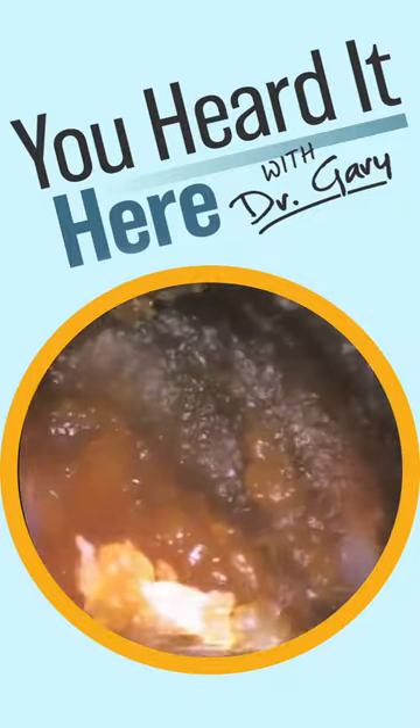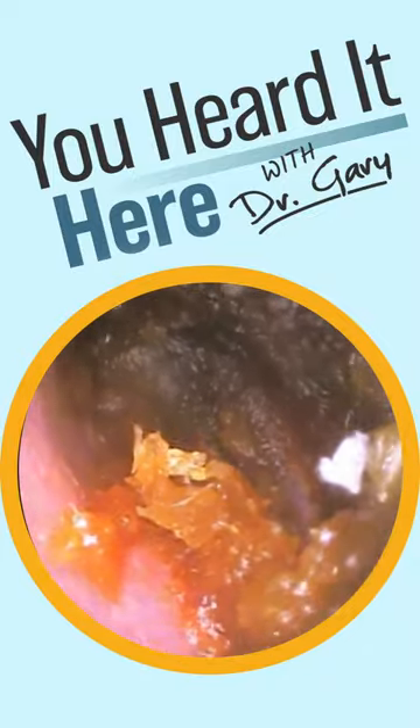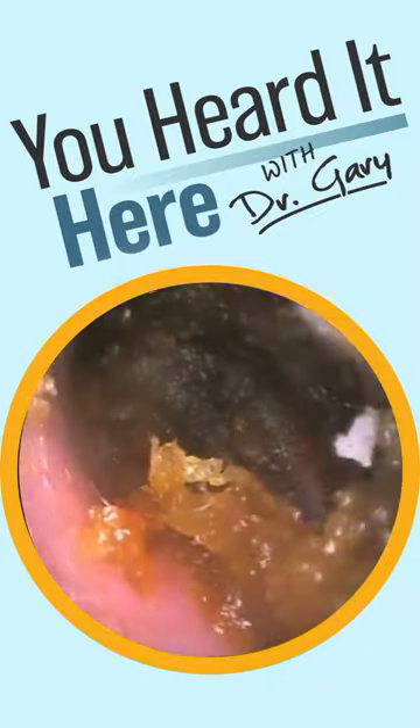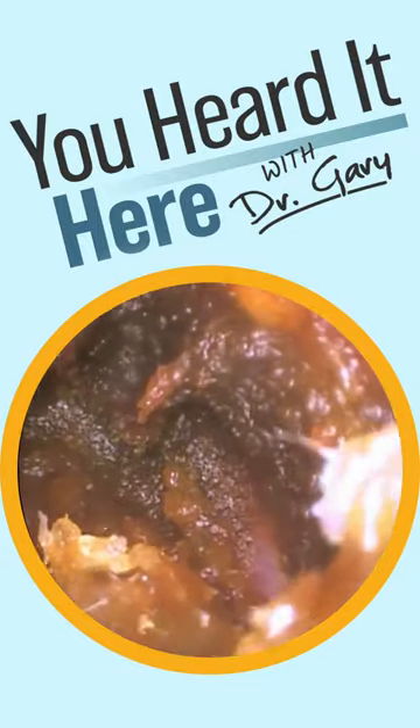Unfortunately for this video I did not have a second set of hands to help with filming, so once I got to the irrigation point you're just going to see what came out afterwards rather than the actual irrigation process.